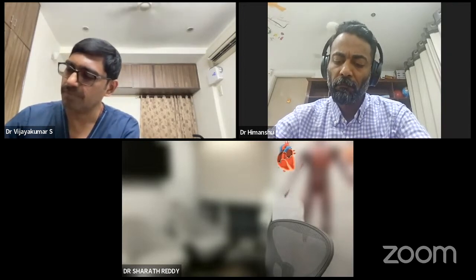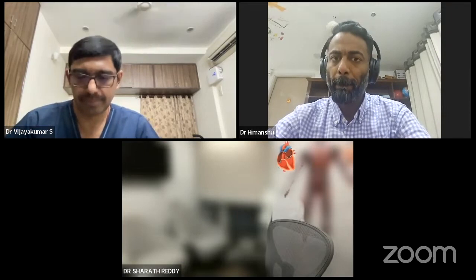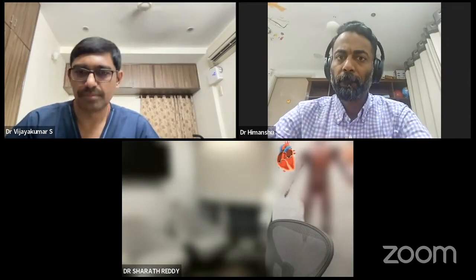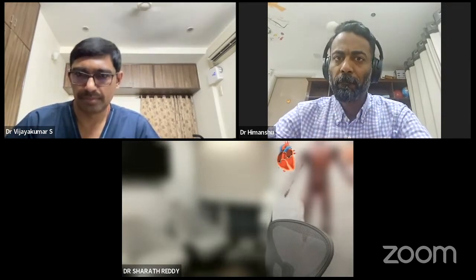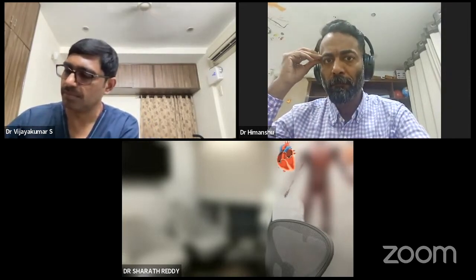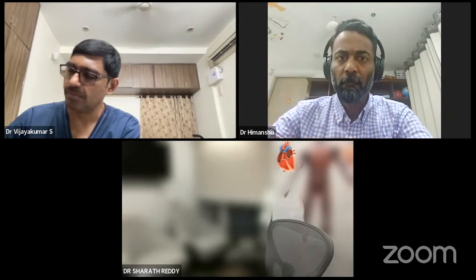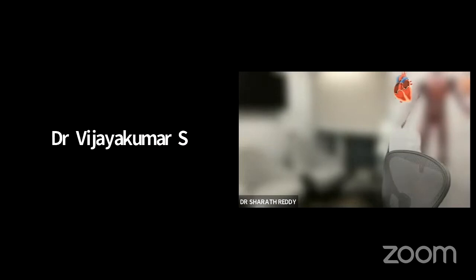So, having said that, I think we'll move on to the live in box. Already, this is almost 2 hours, even after all editing, so I'll try to squeeze it down. About the case, it is a post-CABG scenario with an RCA CTO. What we are doing primarily is, we started with LAD. So that's the reason we took 2 microcatheters. As I already mentioned, I want to just go through this.